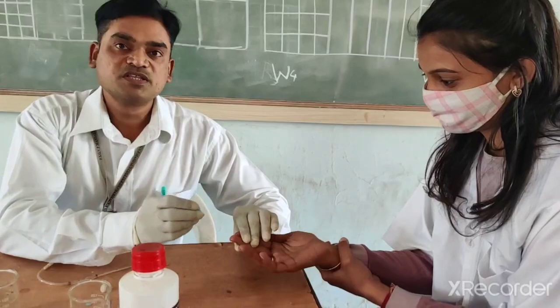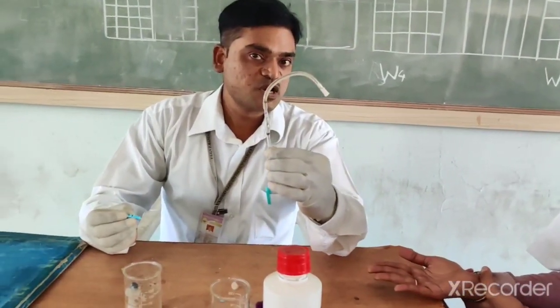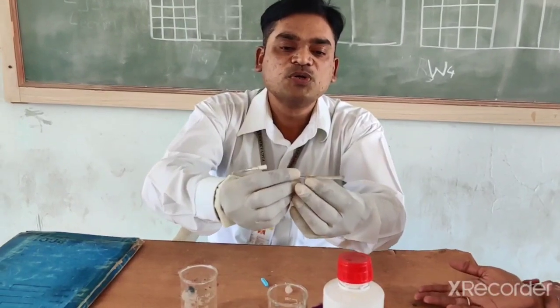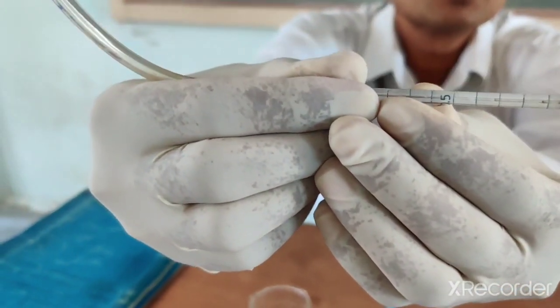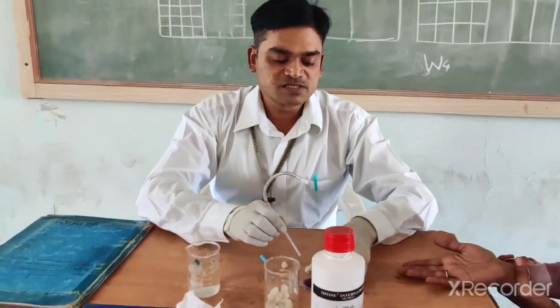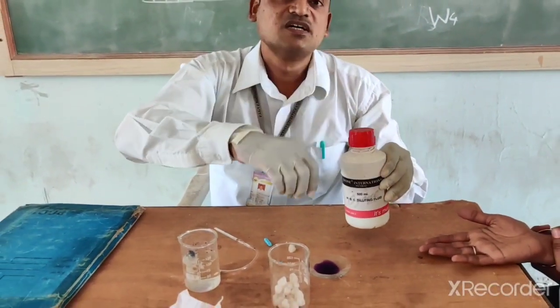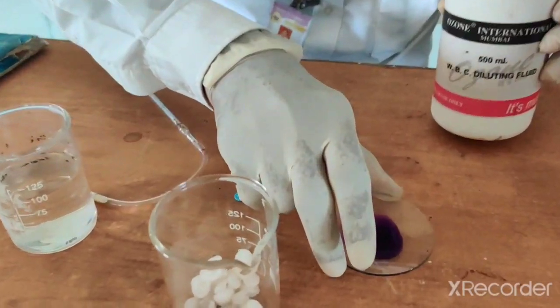Once you treat the finger, you should be ready with this WBC diluting pipette. This pipette is specially used to suck the blood up to the 0.5 mark. After that, you should suck this WBC diluting fluid. This is the WBC dilating fluid, which we have placed into this watch glass using a dropper.